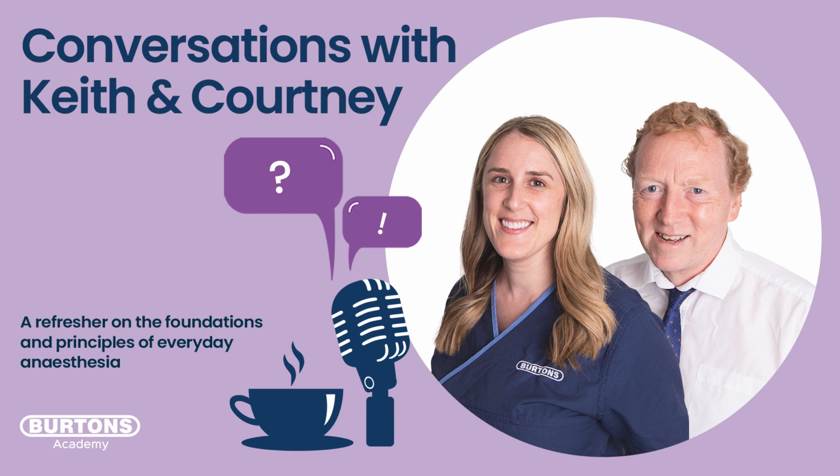Yeah. So my 15.6 kilo dog comes in, and needs to be ventilated. I'm just going to go, okay, 156 mils. 15.6 times 10. Everybody can do that. It's a nice, comfortable figure. We'll moderate it later, but 156 mil. So yeah, I'm going to set my ventilator to either 150 or 160. That gives me a good starting point.